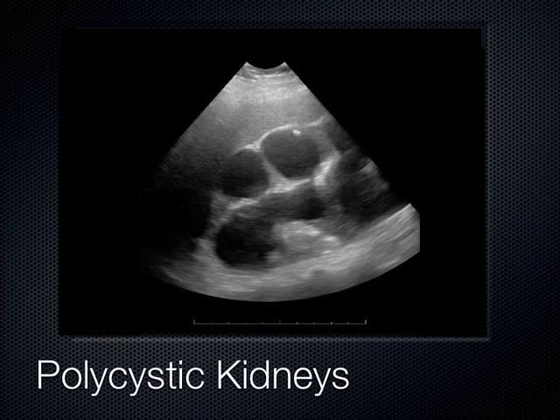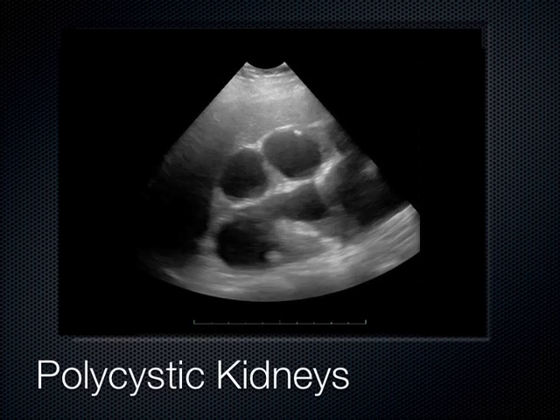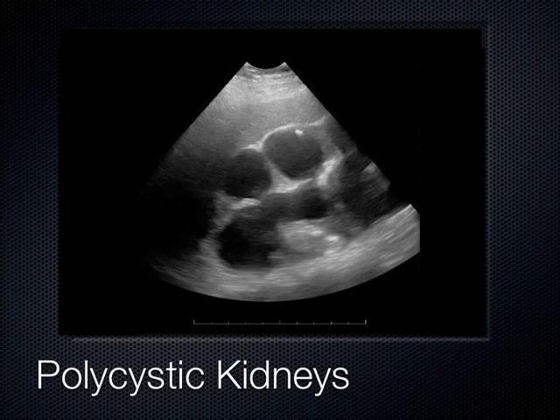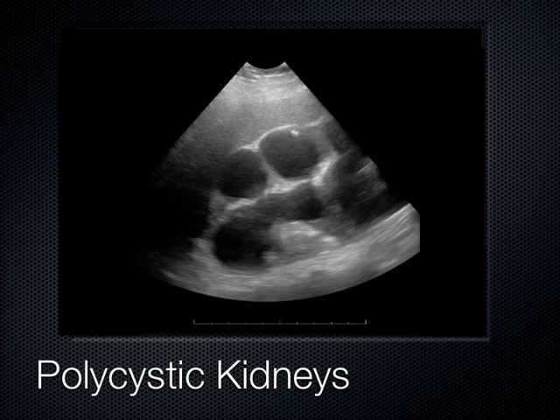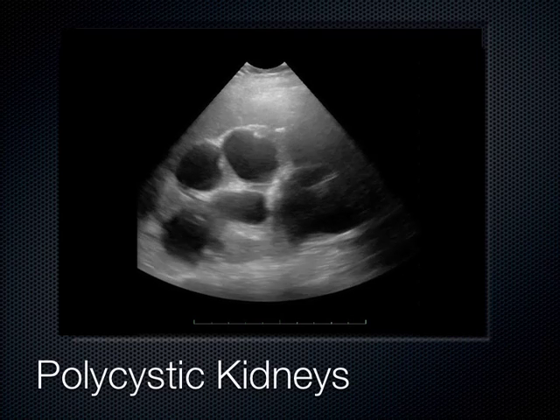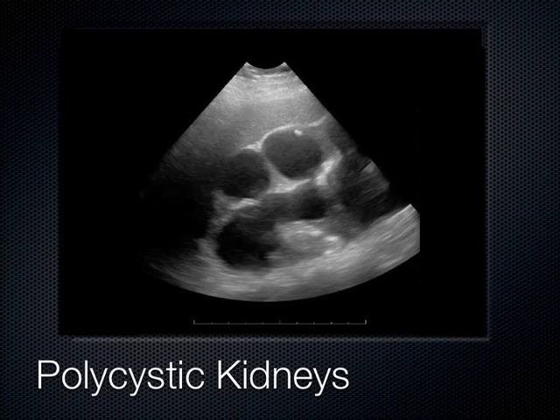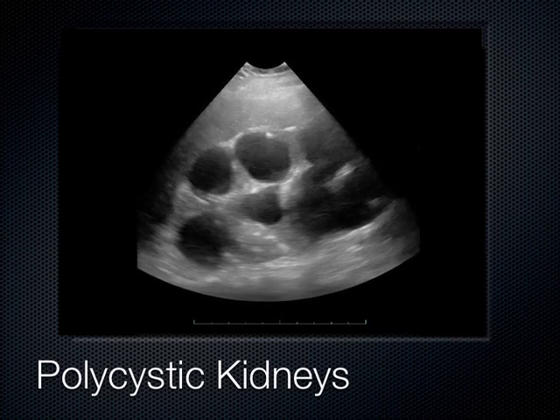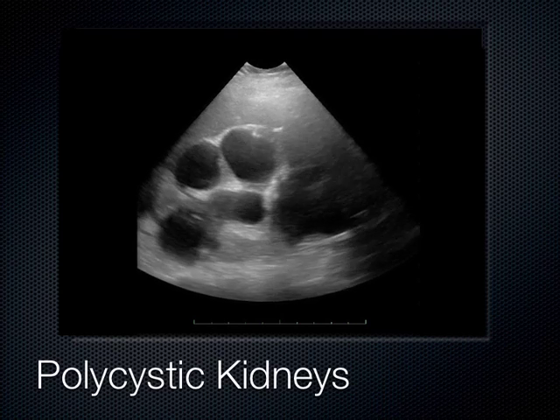You heard of polycystic kidney disease? This is what it looks like on ultrasound. These are all these cysts seen out here in the cortex. We can make out that one here, this one here, this one here, this one down here. Polycystic kidneys, and it's bilateral. And you can see it also affect other organs. Sometimes you can see cysts in the spleen. You see them around the liver. Ovaries look like this when they have polycystic disease.